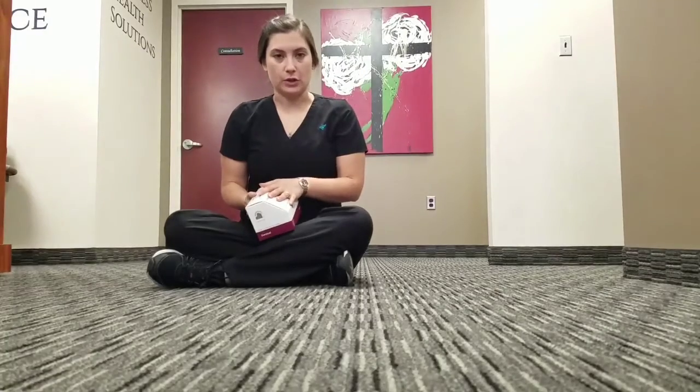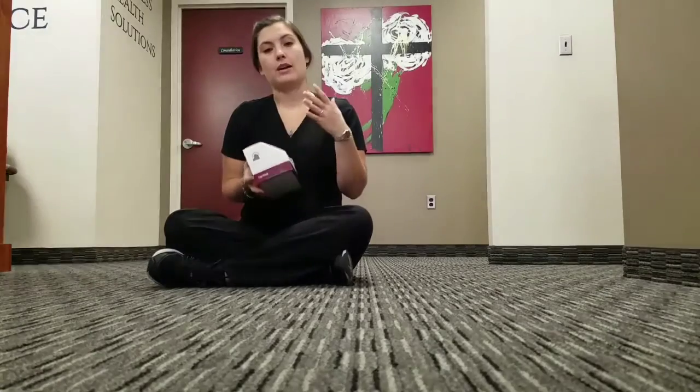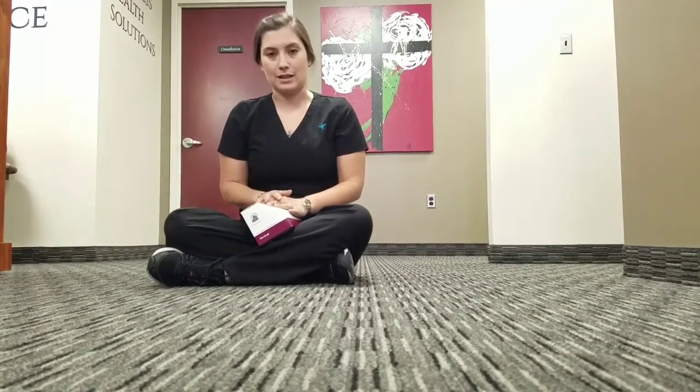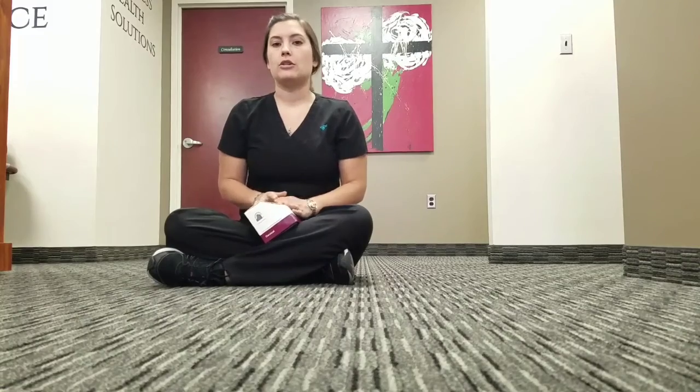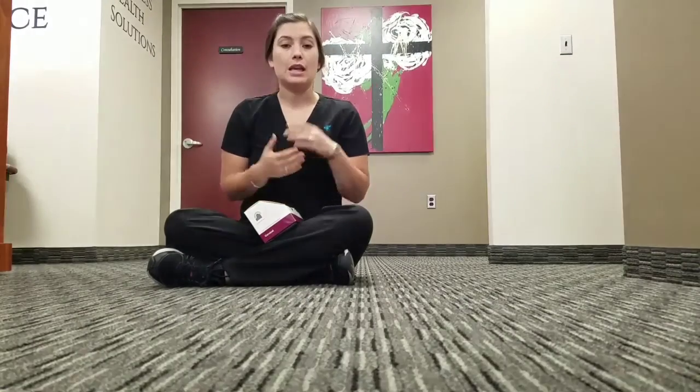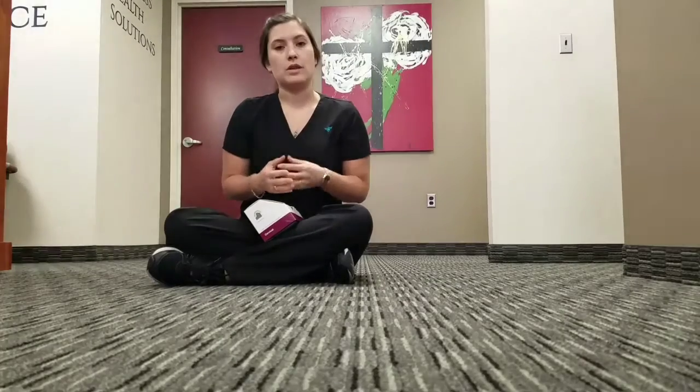Okay, so you have been prescribed the Denneroll cervical pillow. I'm going to instruct you on how to use it and place it properly. It's important that you follow the doctor's instructions exactly when you're doing this. So whether they tell you to do it on the lower, middle, or upper neck, that's exactly where you need to put it. If you're not sure, even after watching this video, please consult with one of the doctors before using it so we can make sure you're doing it in the right place.